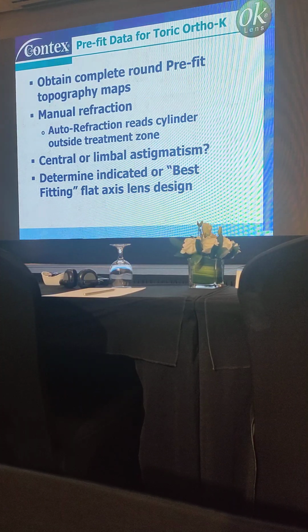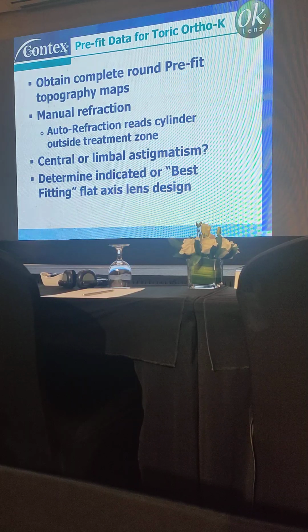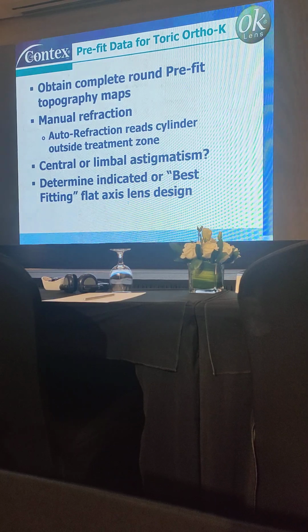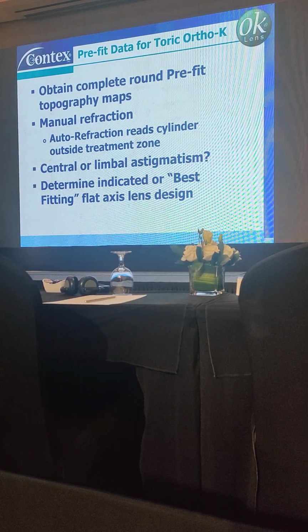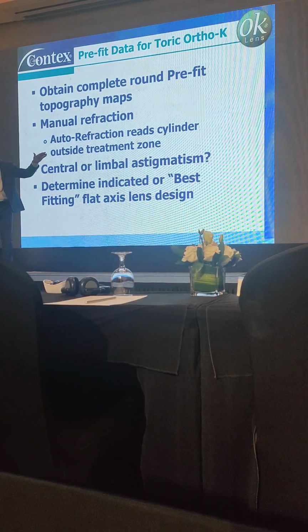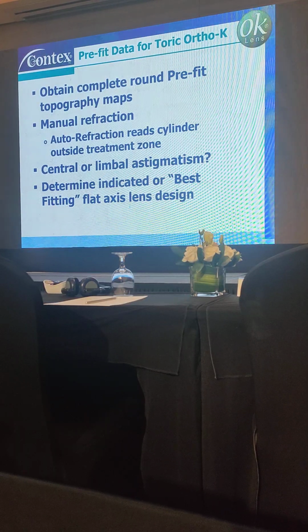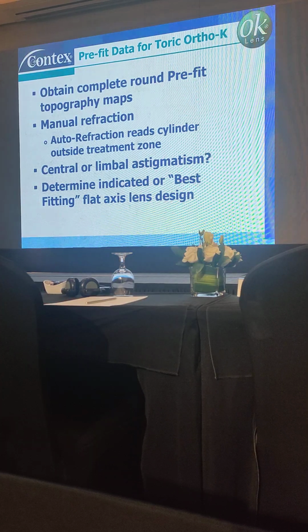I can't tell you how many doctors send us the autorefractor and they say the patients are seeing good, but they have so much astigmatism. So that's another important pro tip. And then trying to figure out, is it central or limbal astigmatism? And everyone knows the difference between central or limbal astigmatism, right? Pretty much? Yes?